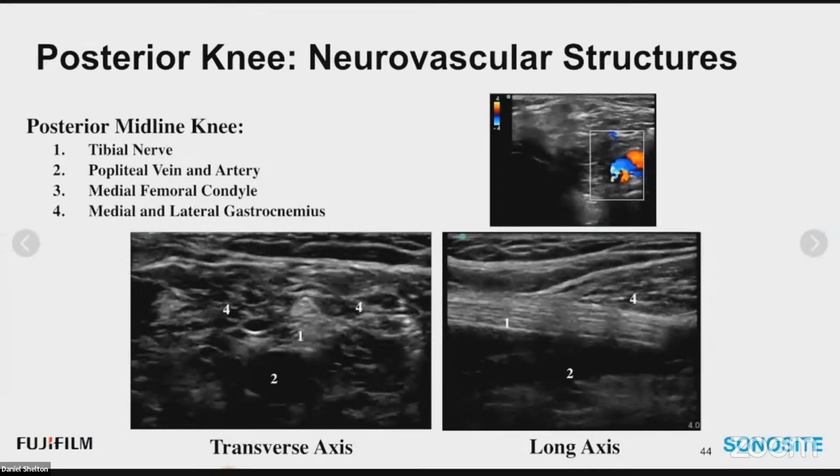Being able to follow each individual fascicle of a nerve is a huge advantage of identifying what's a nerve and what's not a nerve. And then your epineurium, which is nice and bright, typically is less angle dependent. It's mostly fat. It shines very, very hyperechoic, even when it's diving. And that's what makes a nerve easier to identify than some of these tendons.